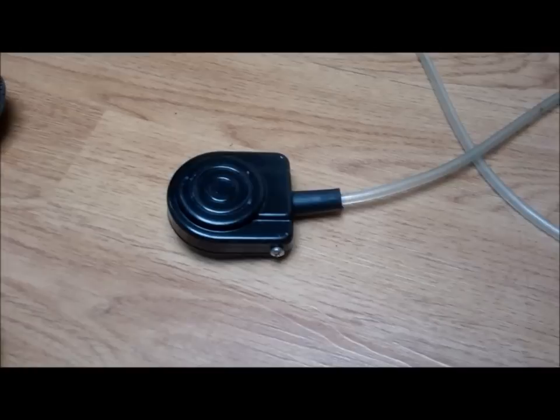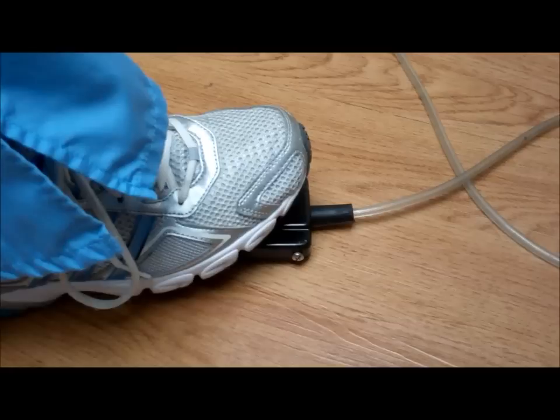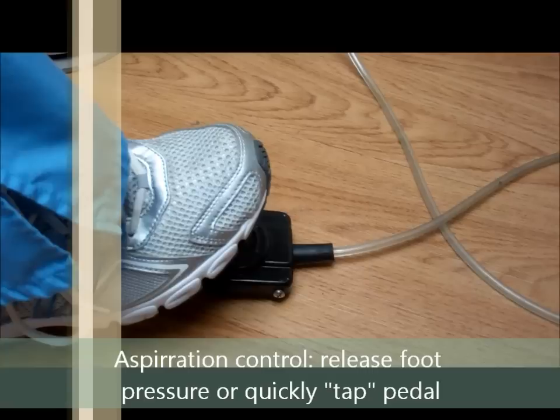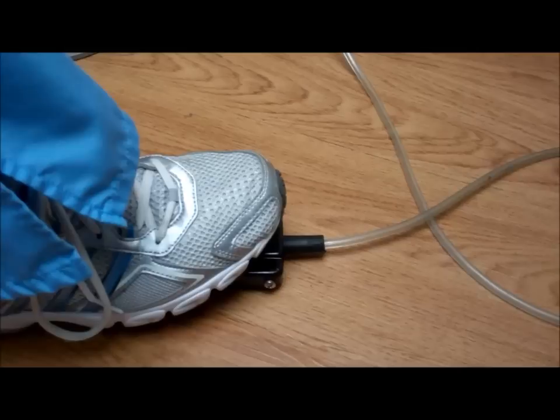There are two specific rates of delivery when using the STA. Light pressure on the foot pedal dispenses 0.5 mL per minute, and firm pressure on the pedal dispenses a fast rate of 1.8 mL per minute. Aspiration is controlled by releasing the foot pedal — a tap of the foot pedal indicates aspiration. Gentle pressure on the foot pedal is a slow rate of delivery, and by firmly pressing your foot on the foot pedal, the faster beeps indicate the second speed of delivery.